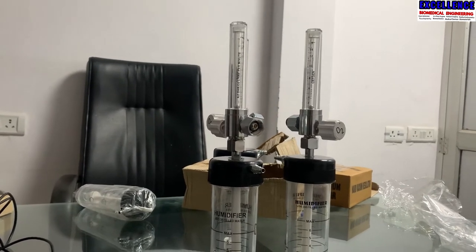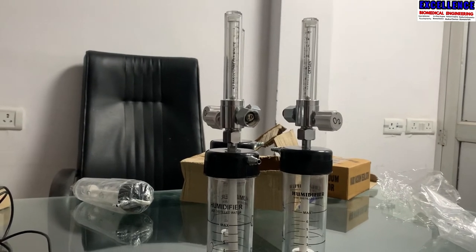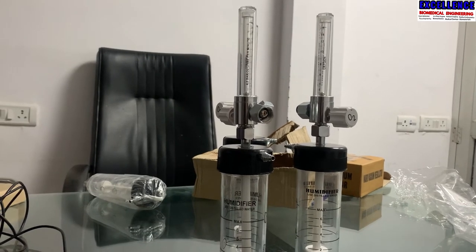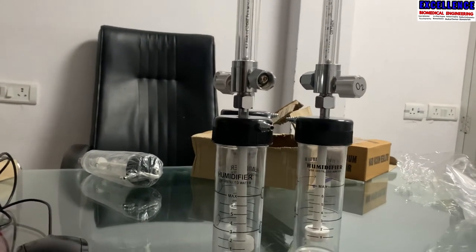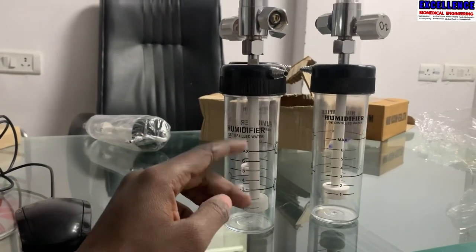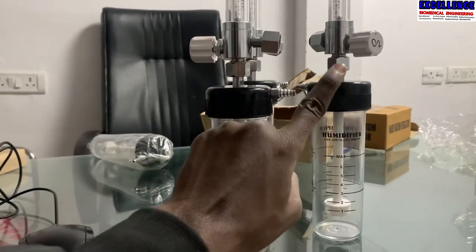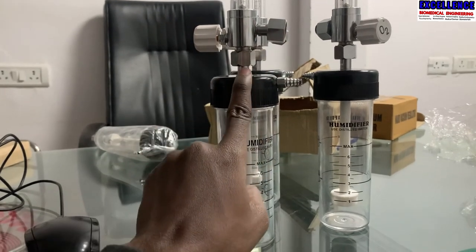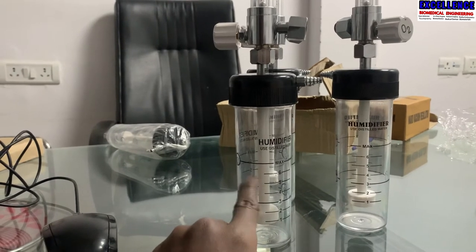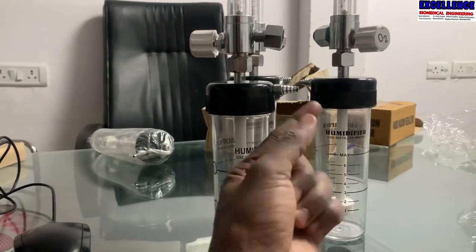So how does this oxygen humidifier bottle work? What happens is that oxygen passes through distilled water — there is distilled water placed here in this bottle. Oxygen comes from the main supply, and when it comes from the main supply it goes directly through here, and then passes through the distilled water. There is a pipe that is going to be provided here to supply the oxygen.